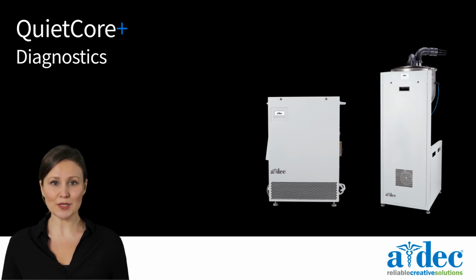In this video, we will discuss viewing diagnostics on a QuietCore Plus vacuum or compressor. Note, the diagnostics available will be different between a vacuum and compressor. In this video, we will be demonstrating using a vacuum.